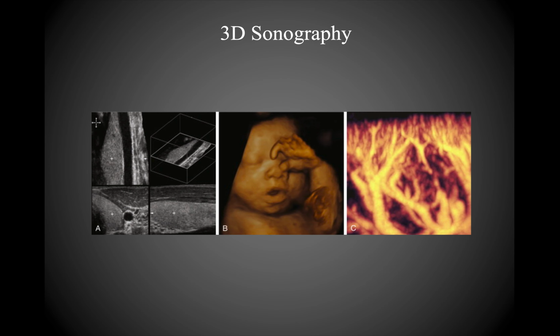And then finally, therapeutic ultrasound, as opposed to diagnostic ultrasound, like what we're talking about, where we use ultrasound to generate images that can then be used to diagnose various diseases and/or injuries, is also actively being developed for a number of conditions. One of the most notable is for Alzheimer's disease and other dementias. They're looking at opening or basically treating the blood-brain barrier with ultrasound and thereby generating a potential therapeutic effect. And again, there's a number of other examples where that's occurring as well. So again, ultrasound is a growing field.